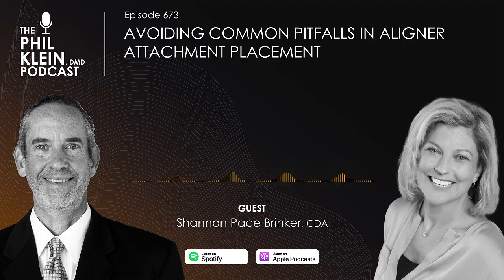So every room has these little flashlights that I got off of Amazon, and they just shine it in the light. We have it in every room. So even during the hygiene appointment, they're checking to make sure that every aligner, every attachment is intact. What will they see with the black light if an attachment is missing or fractured? It'll look funny. A little bit of the flash will still be there, but it won't be a real shape. So it's visible with the naked eye with the flashlight.